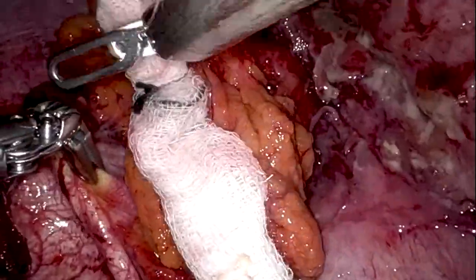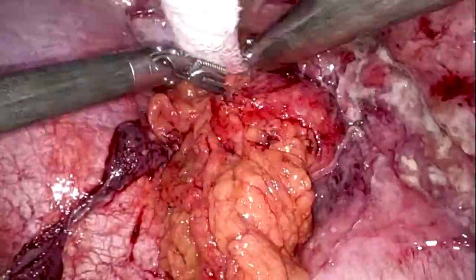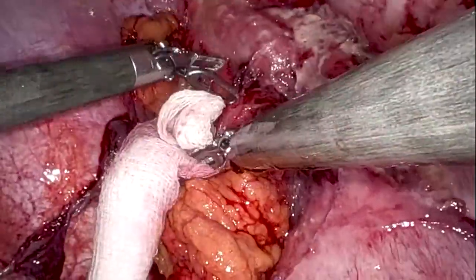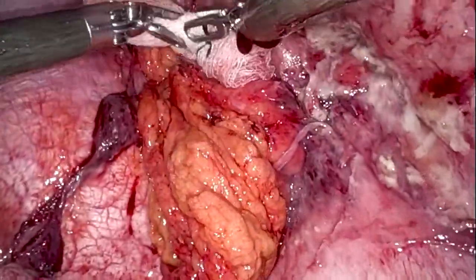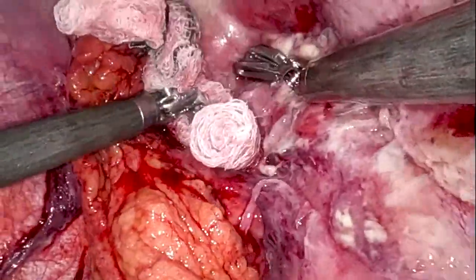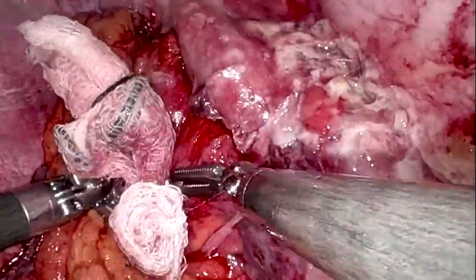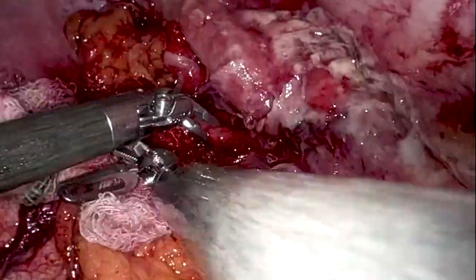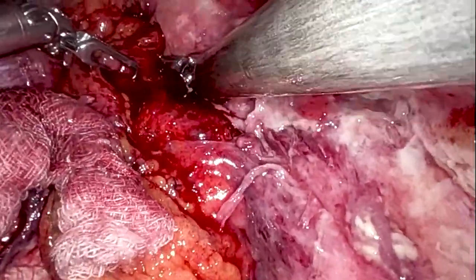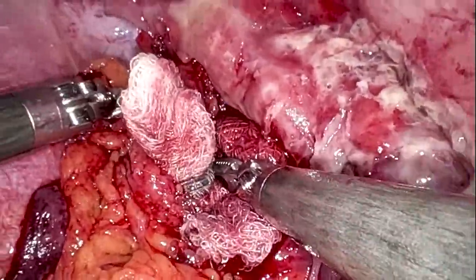The patient was stabbed 72 hours prior to this operation at a party. On CT scan, blood or fluid seen in two separate compartments — the thorax and the abdomen — almost always diagnoses a diaphragm injury. Importantly, with penetrating trauma like a stab wound, you get a very clean diaphragm to suture, unlike blunt trauma such as a car crash which typically leaves a tatty, frayed diaphragm much harder to repair.